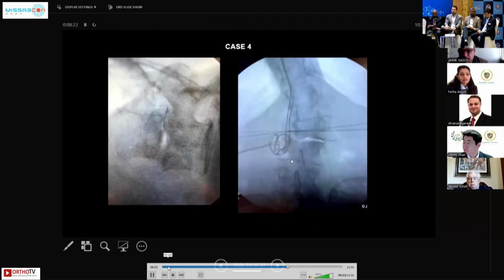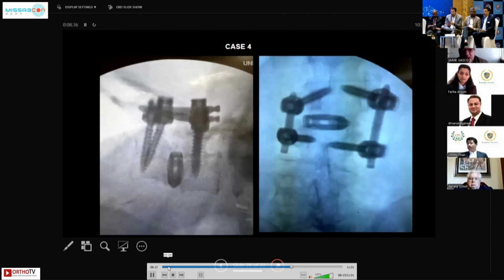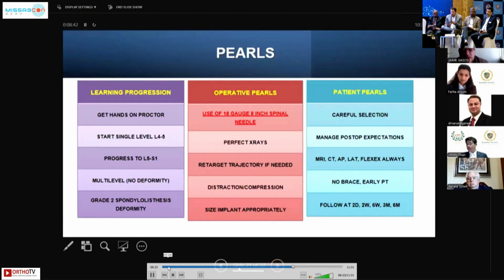Patient came to us, and looking at these films, we decided two things. One, the spinal cord stimulator needed to come out because it wasn't really working, but then she needed stabilization and correction of her coronal deformity. So the easiest, simplest way was an OLLIF, which was accomplished in approximately 25 minutes. And the patient did very well, and her clinical symptoms resolved.